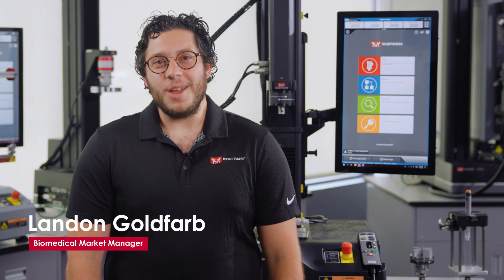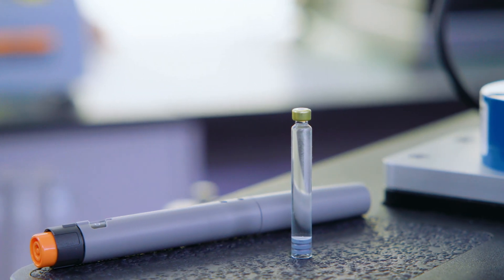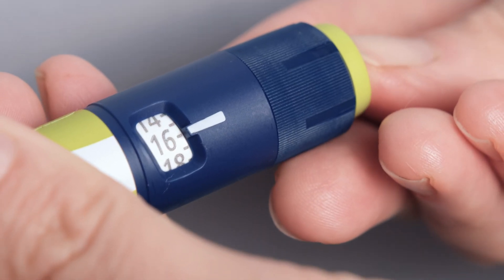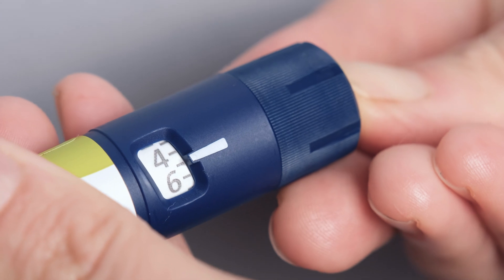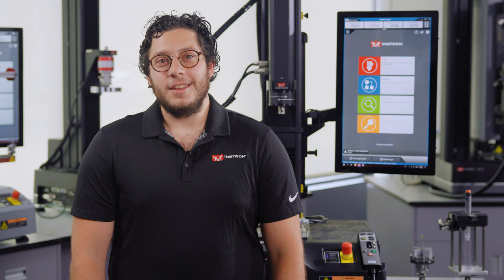Hi, I'm Landon Goldfarb, Biomedical Market Manager here at INSTRON. Today we're going to take a deep dive into the mechanical testing of insulin delivery devices. Diabetes is quickly becoming one of the world's greatest public health crises. Over time, the complexity and volume of treatment devices has increased, leading to expanded requirements for mechanical testing.